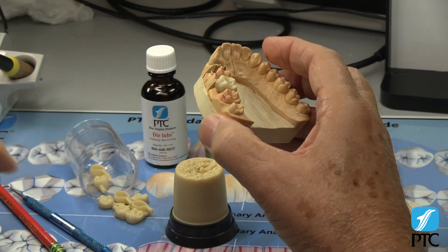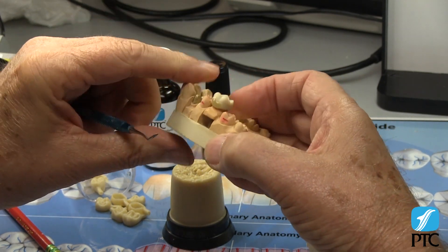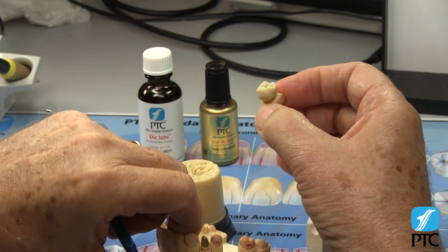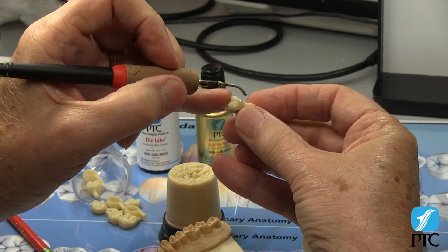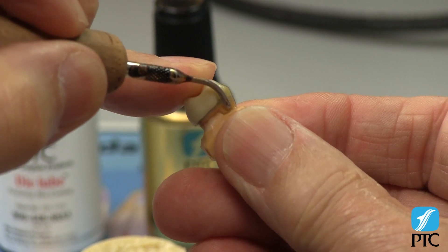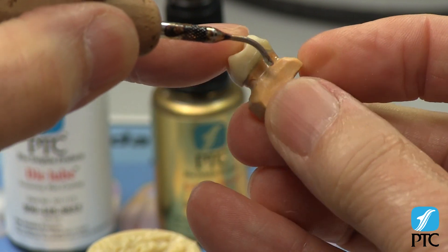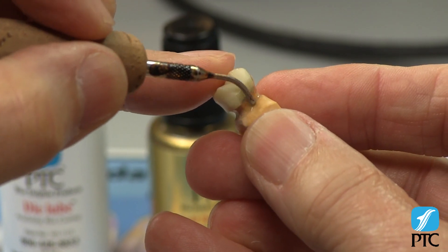Now remove the die and proceed to seal the pattern to the margin. Hold your waxer approximately 15 degrees to the axial wall of the crown. Place the tip of the waxer in the undercut and simply rotate the die to seal the wax to the margin all the way around. Hold the die vertically so the excess wax will flow into the undercut.